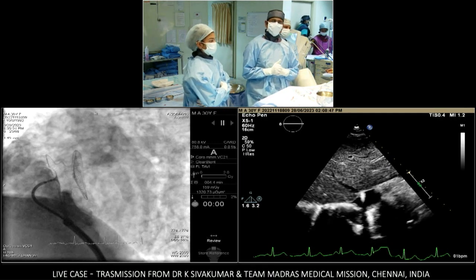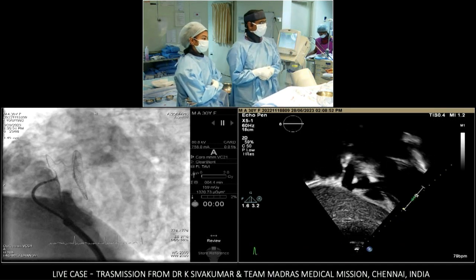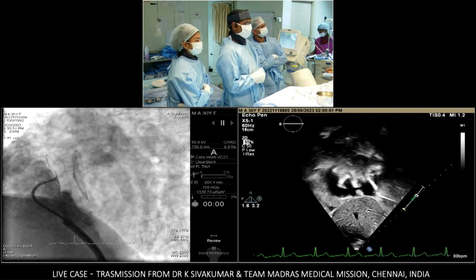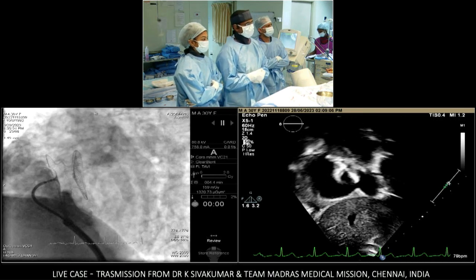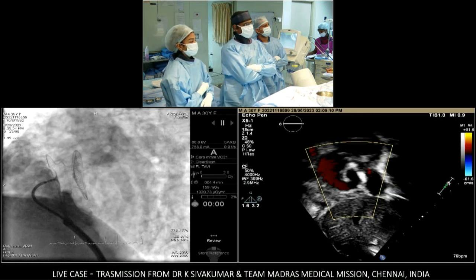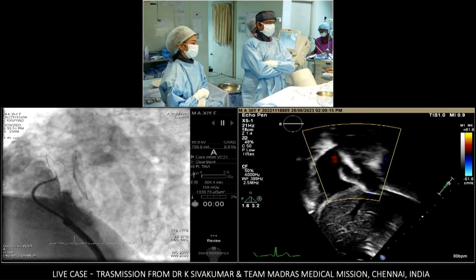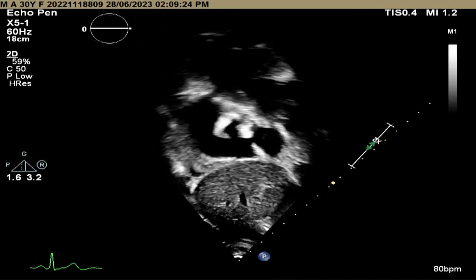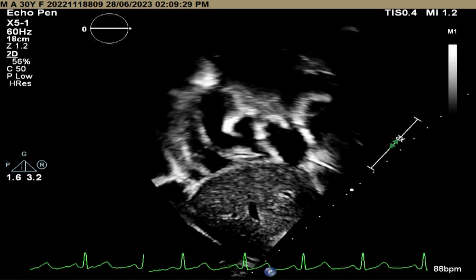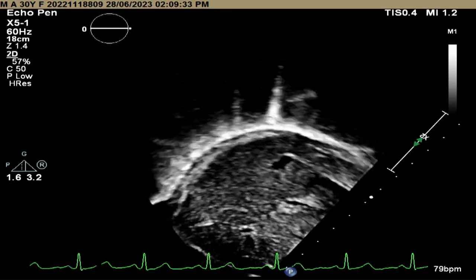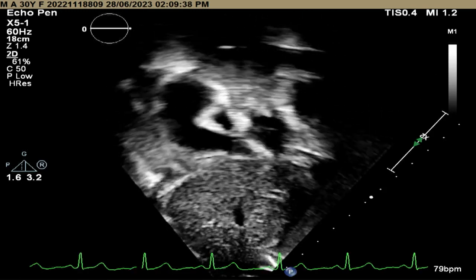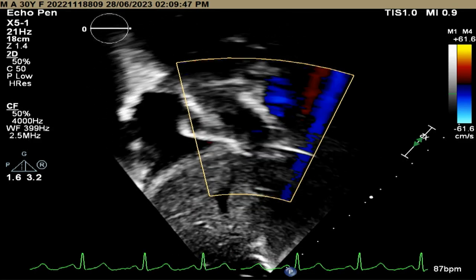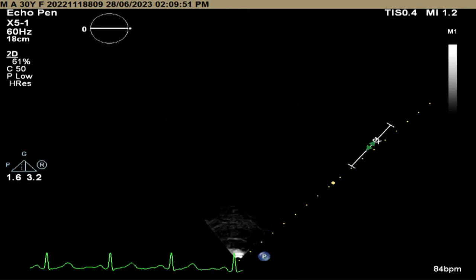The apical four-chamber view from Srija looks quite good. A parasternal short axis with color Doppler is also obtained — the superior vena cava color is seen, the IVC color in blue is seen, and the defect appears closed. The device profile looks almost similar to any other standard ASD closure device. From Frankfurt, a question is raised about whether the IVC rim is adequately caught, and whether there is any color leak. The inferior vena cava color is seen going into the LA disc and turning around.